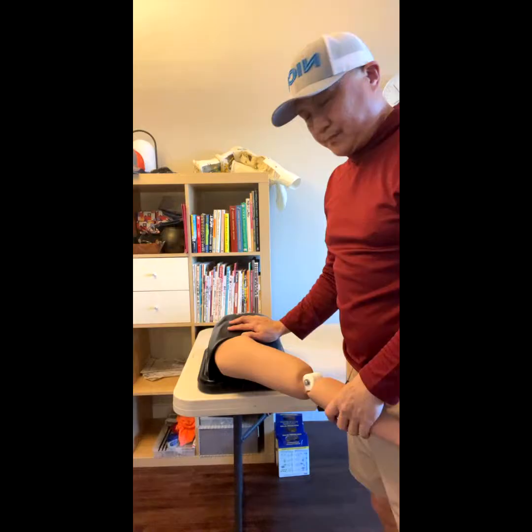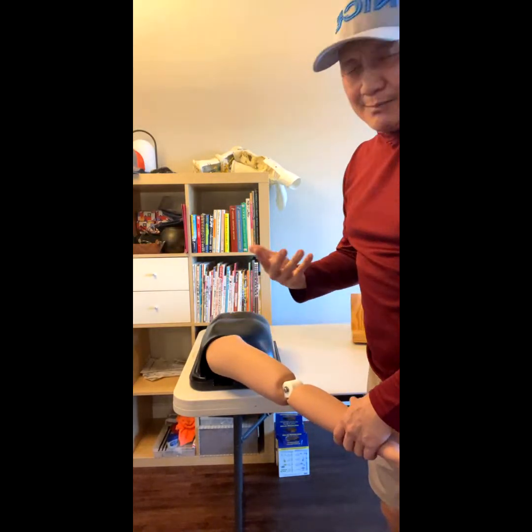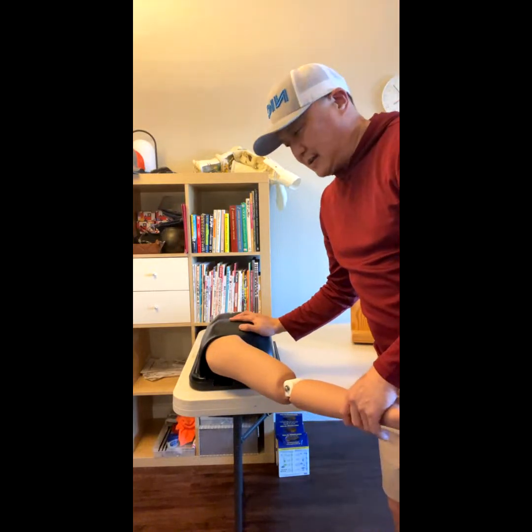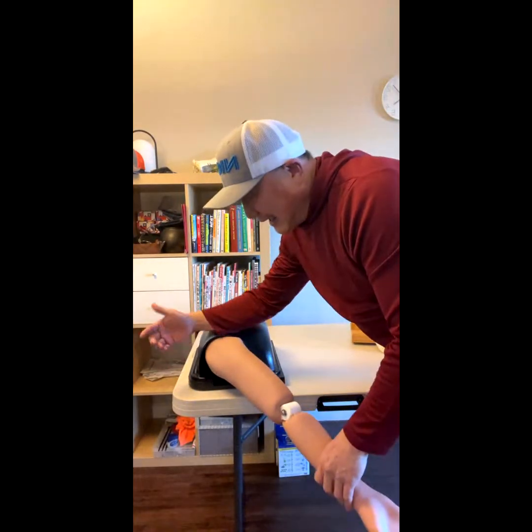Let me show the model. This is the modified Hippocratic technique. The true Hippocratic is supposed to have you put your feet under the armpit — I don't do that.